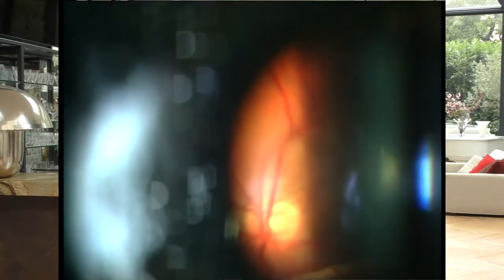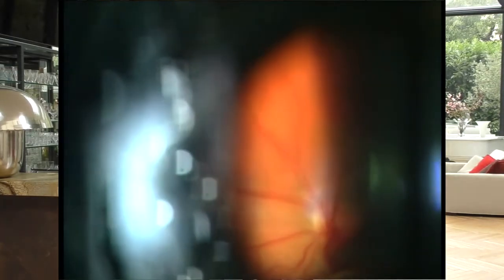Let's finish with a non-contact lens from Volk. The vision of the posterior pole and the vitreous is not bad. Not as good as the quadraspheric lens, but not bad at all. By asking the patient to look in the desired direction, we can have access to the periphery.